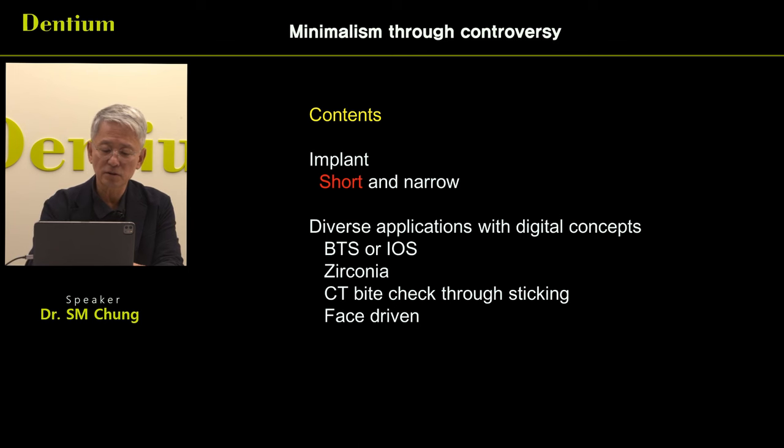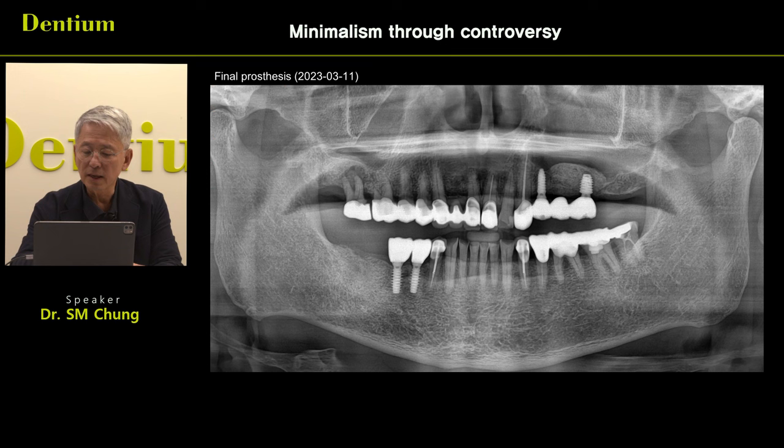At first, about the short implants. In this situation in the sinus, this was a Bright bone level implant, and the length is 7 millimeters. So relatively short, with very minimal augmentation into the sinus. Also this implant has a diameter of 3.5, a very narrow diameter implant.